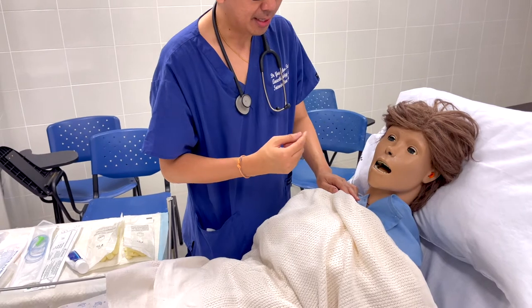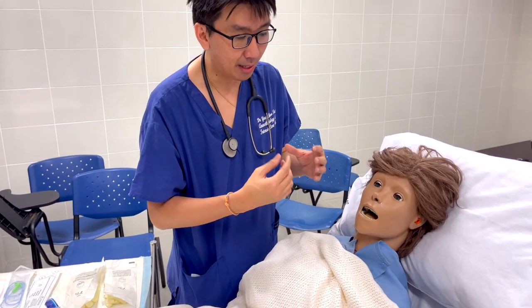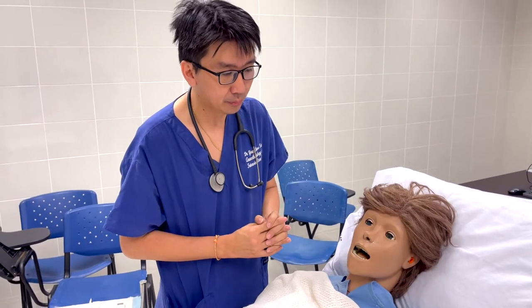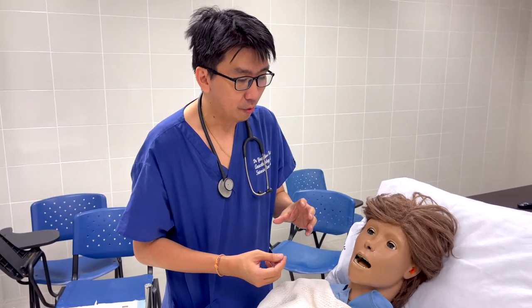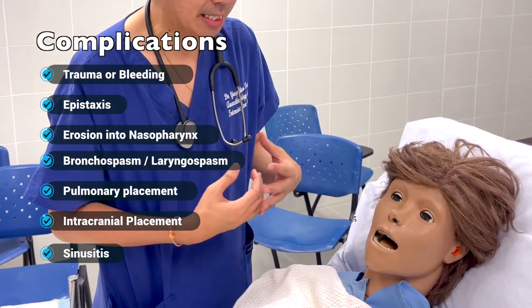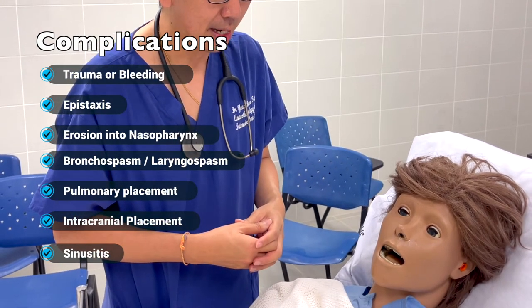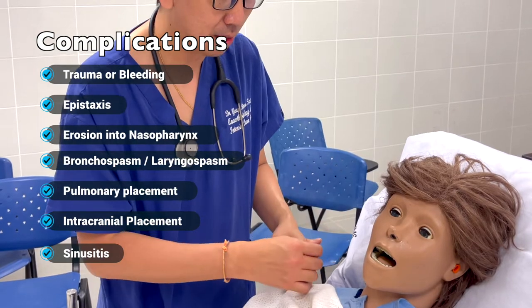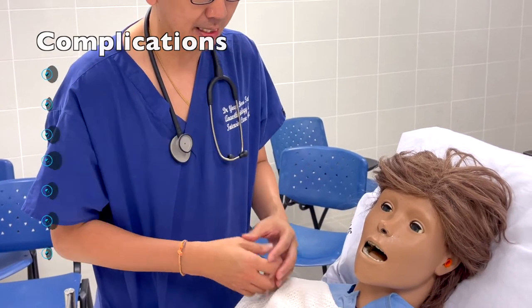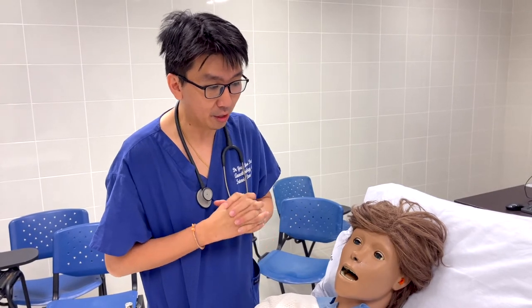You will feel a bit uncomfortable and uneasy, but don't worry. I will apply some lubricant — KY jelly containing an anesthetic agent — so it will not be too painful during insertion. The tube will be in place for at least two to three days until your condition improves. Complications of inserting this nasogastric tube may include some bleeding from the nose, possible infection at the nostrils, and rarely perforation of the esophagus. We will take precautionary measures and be gentle throughout the procedure.